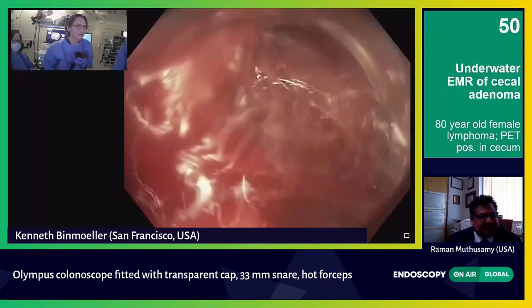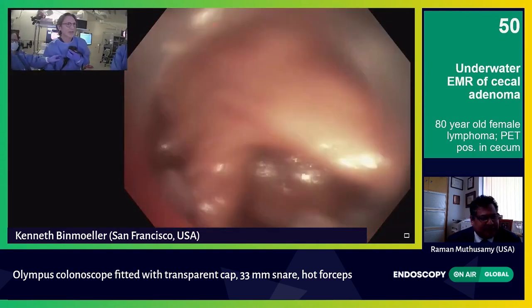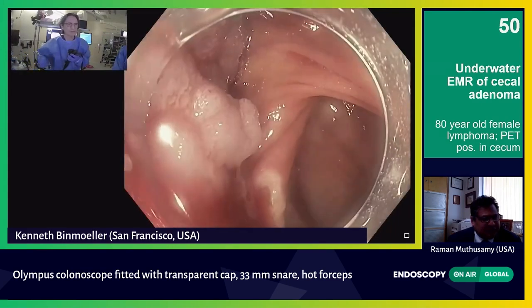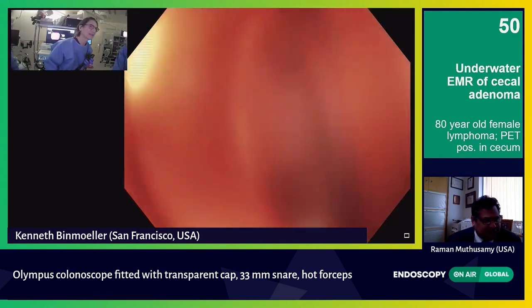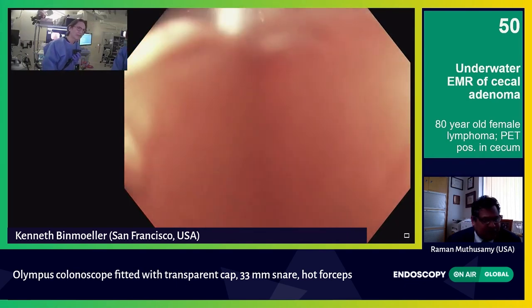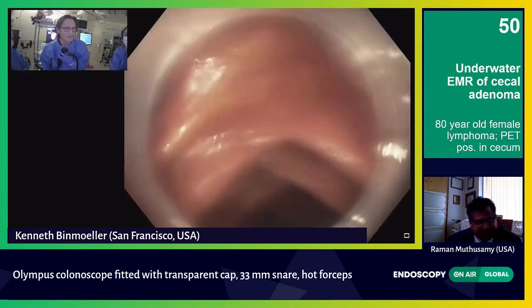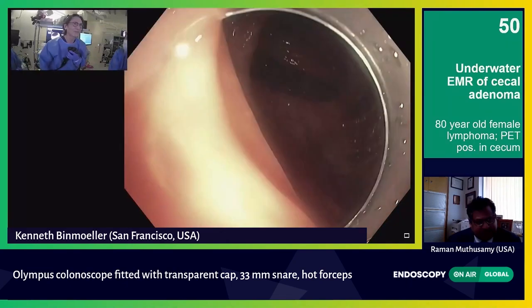I had already difficulty getting into the cecum because of looping, but fortunately we got in there. The last part of this is the closure — I always close these lesions. I just need to stop, get that blood vessel that's still oozing, and then take the biopsy forceps out. This big polyp's in my way, so I want to suck it into the cap and pull it down into the ascending colon and deposit it there. My assistant is giving pressure because of the looping.